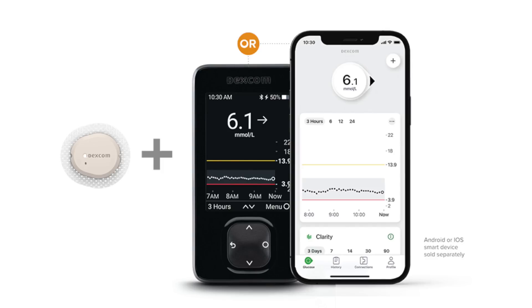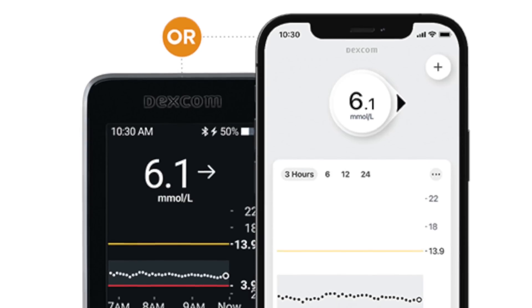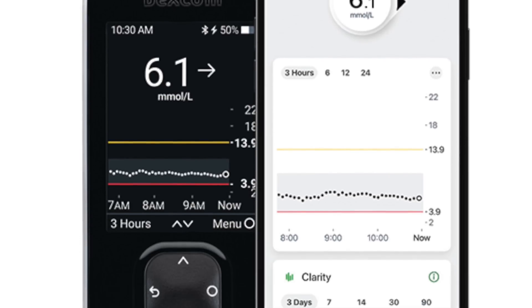Finally, the Dexcom G7 has a redesigned mobile app that includes all the Clarity reporting in one single application — no need to download a second one. This new app has redesigned notifications that you can more granularly customize to be more discreet. I've definitely been worried about going to a movie theater and having an alert come through that I didn't want, being disruptive even though I knew what was going on with my blood sugar. So I'm really excited about the new alerts on the G7.